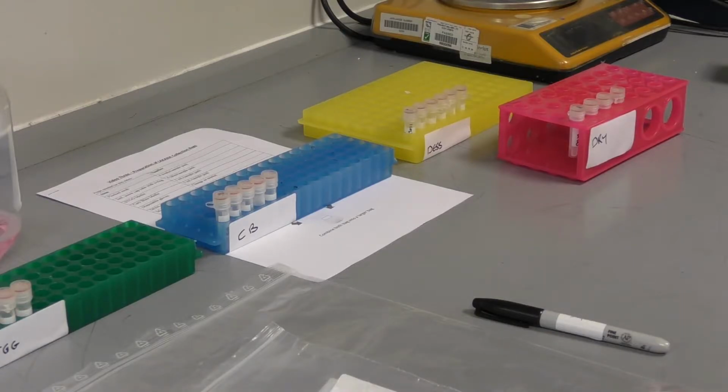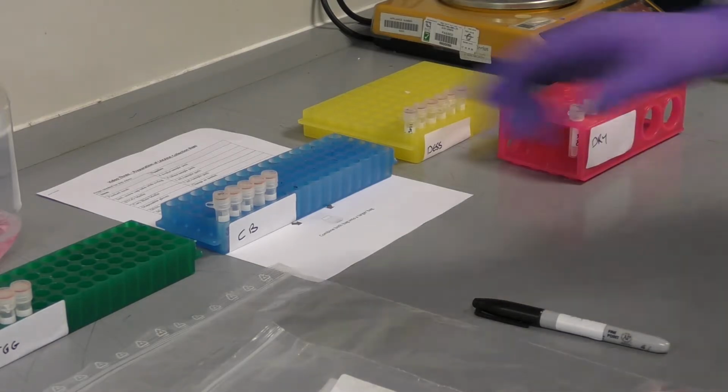We are now going to look at the preparation of the LAKANA collection bags. Firstly, we will put together the nasopharyngeal collection bags. Then we will put together the rectal sample packs. If you are pre-aliquoting your prepared media with 1 ml of media into 2 ml screw top vials, take them out of the fridge in order for them to be at room temperature.